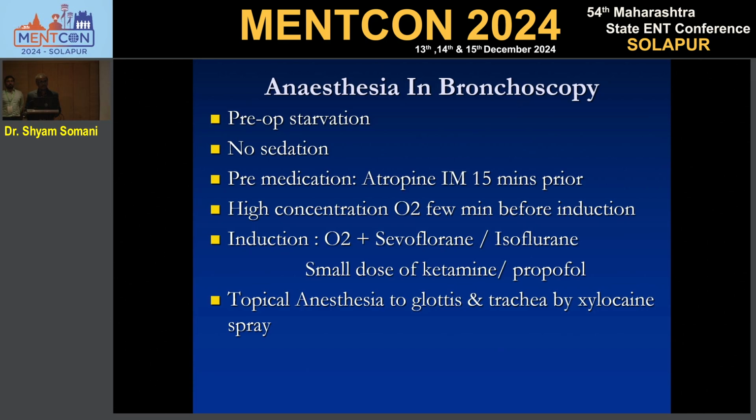Most of the time, don't detach the child from the parents, because he starts crying, and crying exertion will increase his breathlessness. So the best thing is the child should be in the lap of the mother. Then put the IV line there if possible, otherwise with sevoflurane. And induction is as usual with oxygen and sevoflurane.